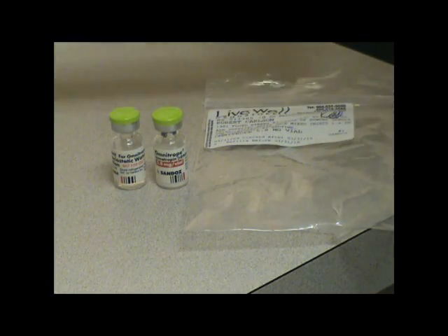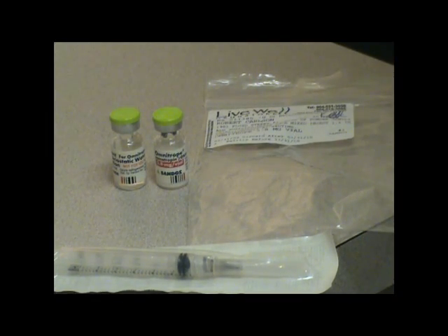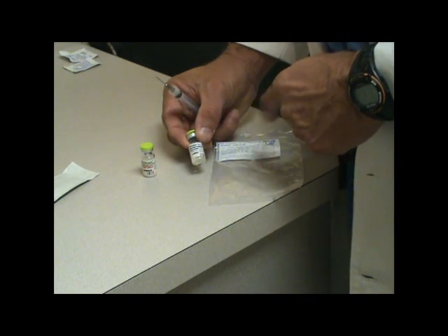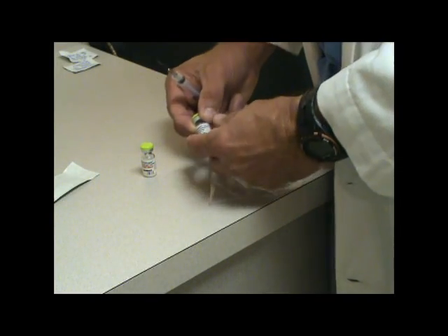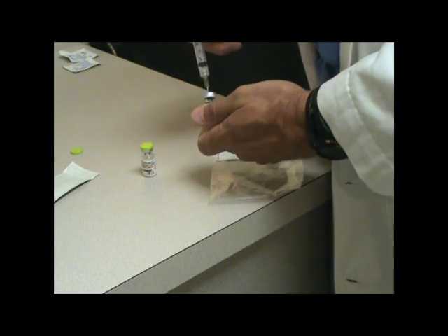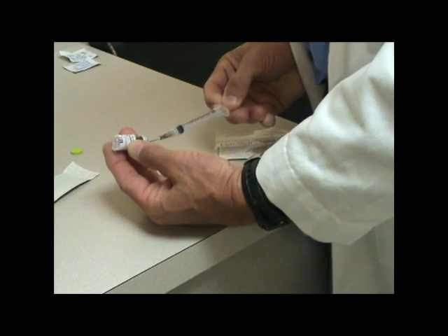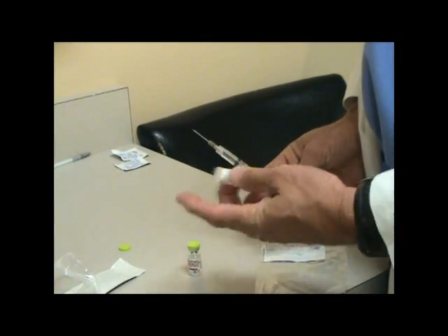You'll need the syringe to draw the water up, and then one of the smaller 0.3cc syringes to administer. Now this is the fluid — there's actually only about 1.14cc's. That's all that's in there; it's already pre-measured, so make sure you get all of it out. You don't have to inject air in there because there's such a small amount. Turn it up and make sure you get the full 1.14cc's of fluid, trying not to have any fluid left in the bottle.